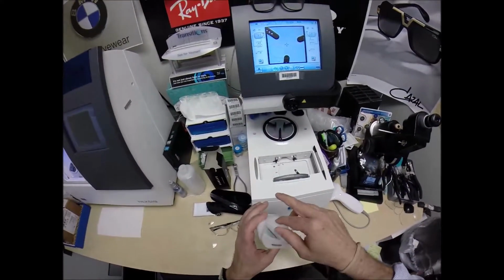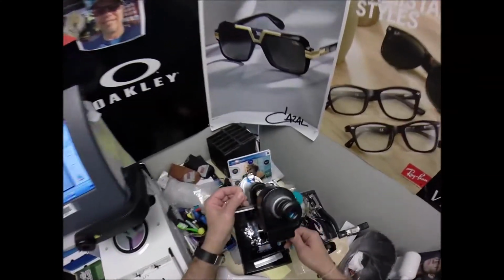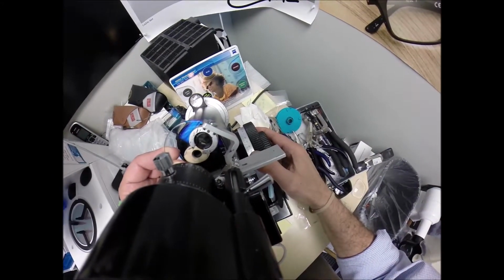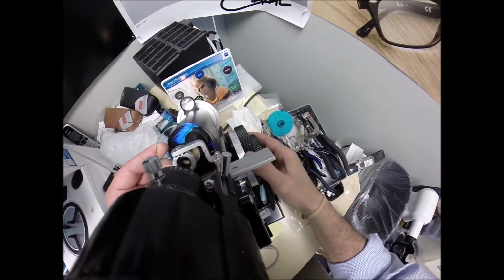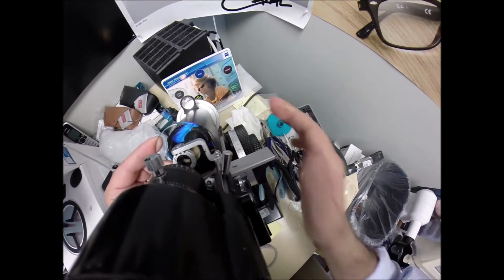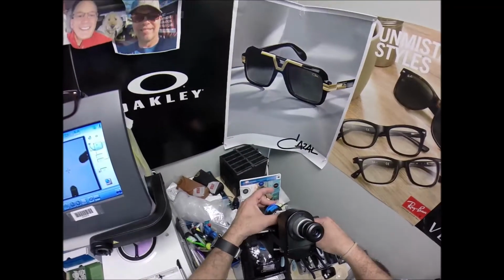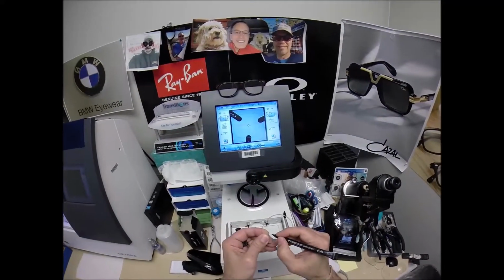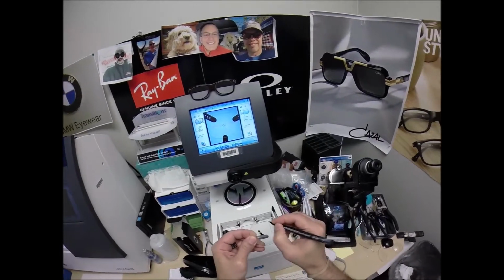Take the lens out of the protective packet that it comes in, along with some stickers that I don't need. I'm going to rotate the lens until the spherical component comes into view first. Just make sure the lens is centered. Check your astigmatism correction. That's good, and I'll explain what all that means in just a little bit. I just want to get everything centered perfectly. Put 3 dots on your lenses. Uno, dos, ocho, and that is the right lens.